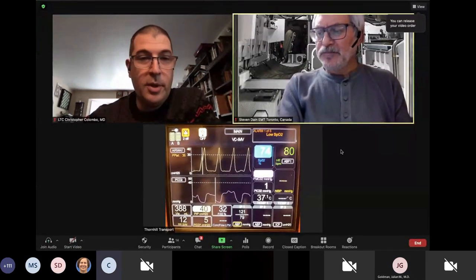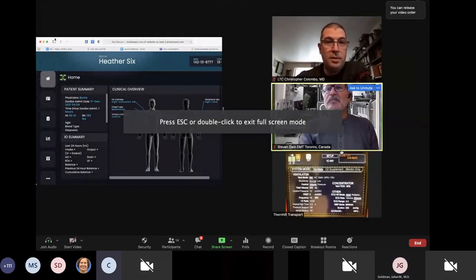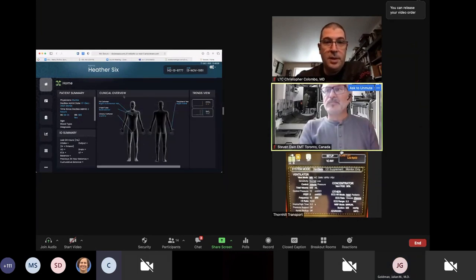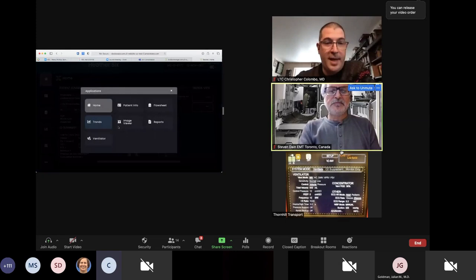No worries. So I'm going to go ahead, folks, and share my screen. So you can see I've already logged into the DocBox environment. You can see us. So Dr. Dan, I just want to verify that this is patient Heather 6, date of birth 13 November 1951. That's correct. Okay. So after I verified the patient, I'm going to go into my apps and choose ventilator.